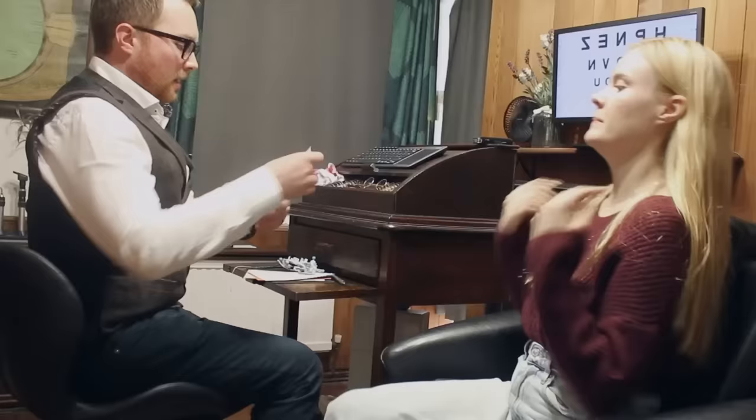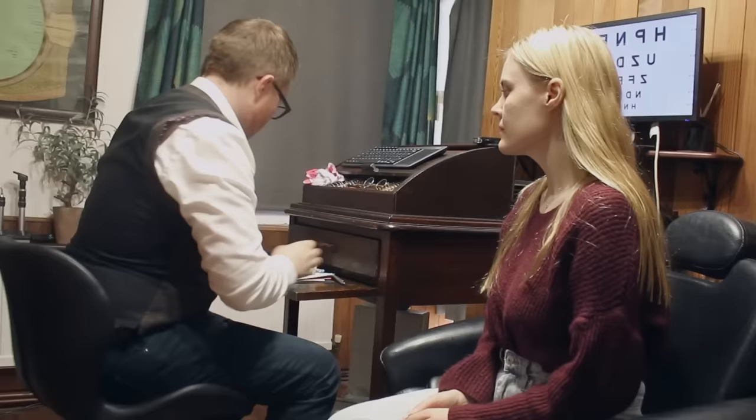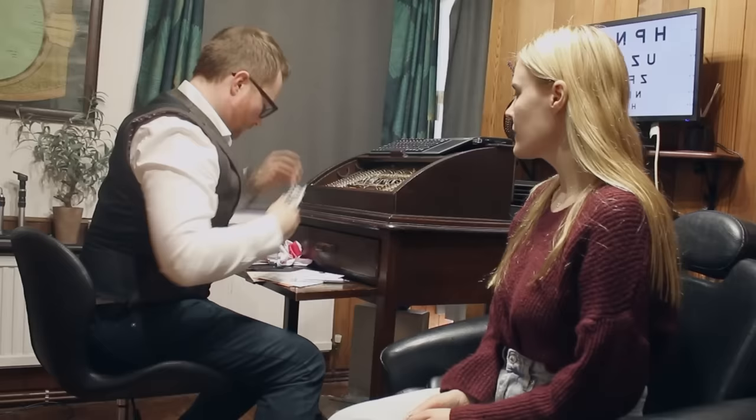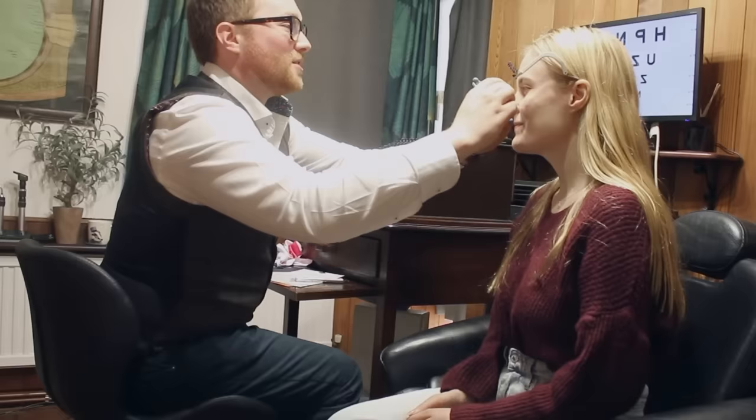So I'm going to get you to have a look into my left. Very good. Right eye. Back to my left. Back to my right. Perfect. There we go. As I say, not the most stylish glasses in the world, these ones.